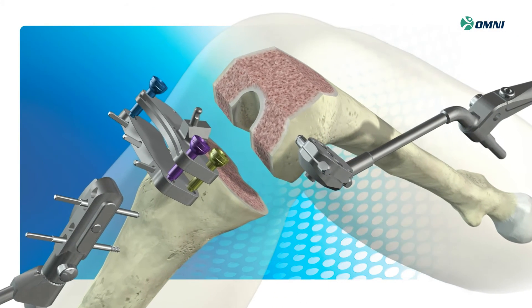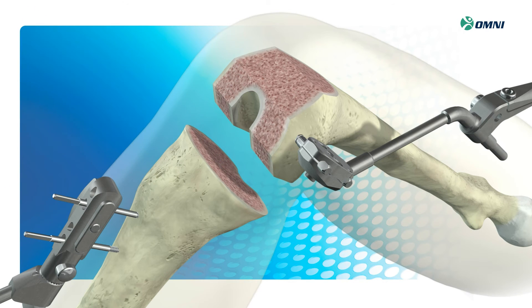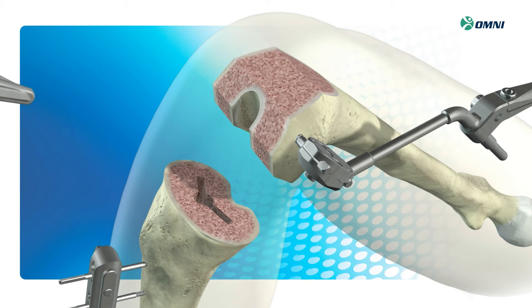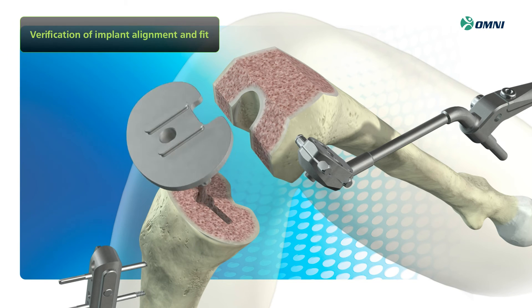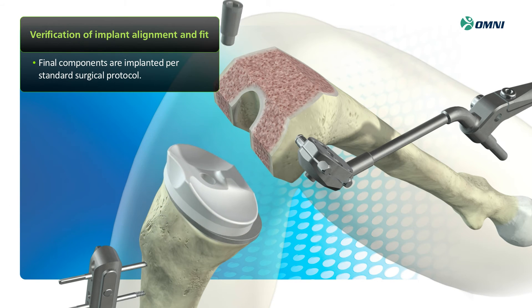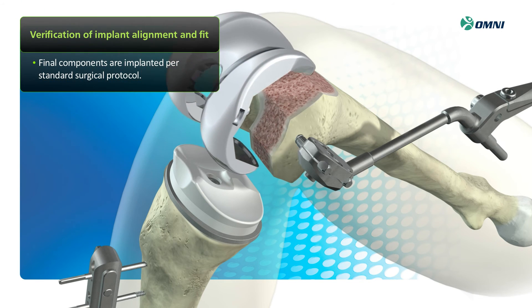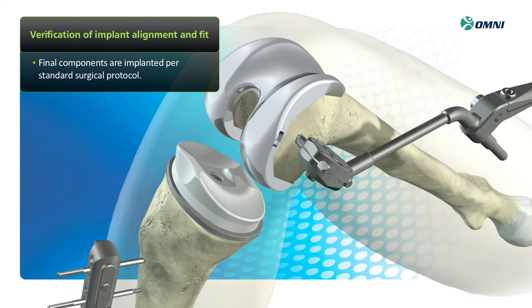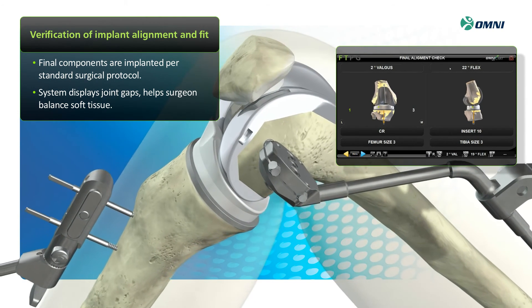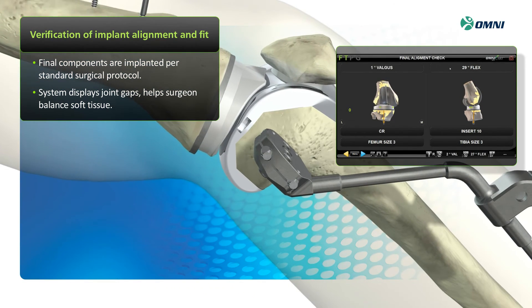Finally, remove the cutting guide in preparation for trialing and final alignment. Trial components are used per standard surgical protocol. With trials in place, the system displays the alignment of the knee through a full range of flexion and extension. This enables you to evaluate that the plan has been achieved as desired and allows for fine tuning, including soft tissue balancing.